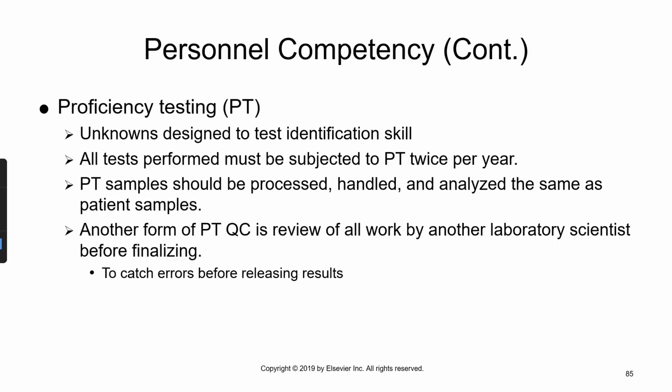Proficiency testing is a good way of doing that. They will give you an organism that's an unknown, and they will watch you work up that organism to produce results. Then you have to identify that organism correctly using the correct procedures by the end of this. You will have all the resources that you typically have. So if you use protocols at work, you're going to have those protocols in front of you. This is not done by memory.